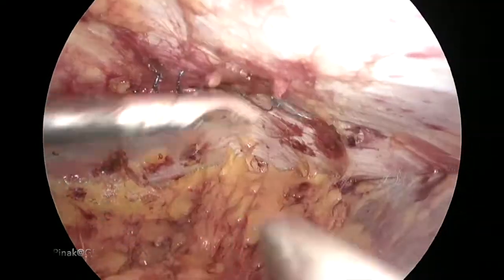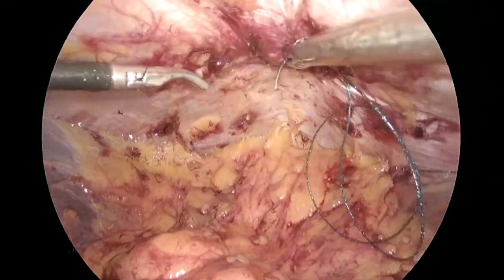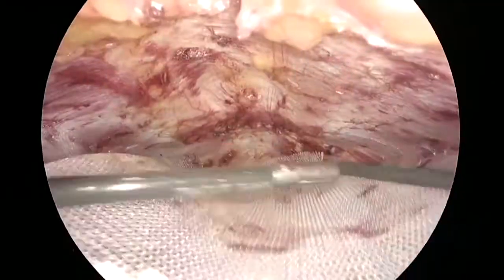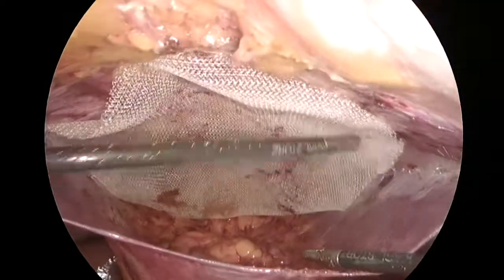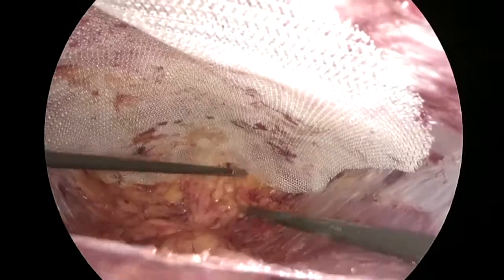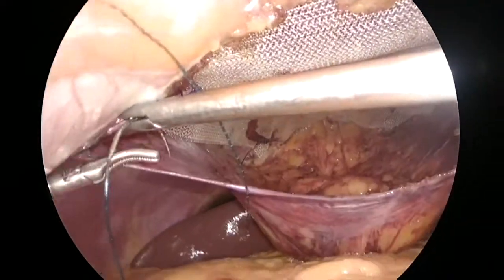We can appreciate that in this location, because of the presence of the falciform fat pad, the preperitoneal dissection is a little bit easier than dissection in the paraumbilical or umbilical area. Similarly, in the suprapubic area, because of the presence of the suprapubic fat pad, the dissection is also a little bit easier.